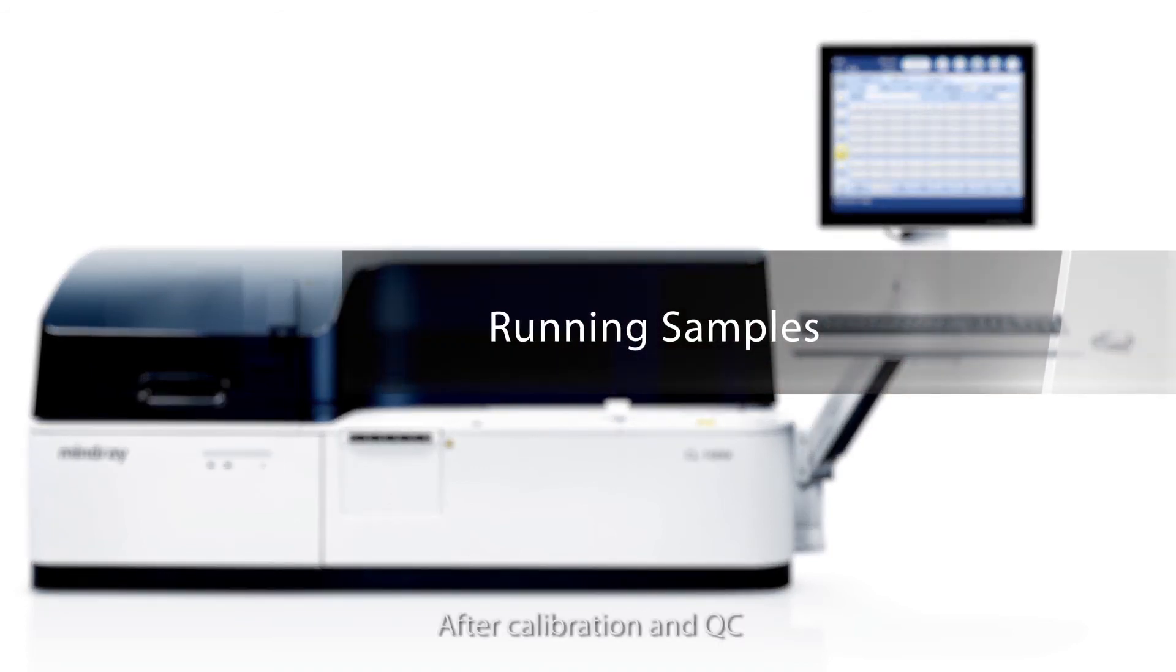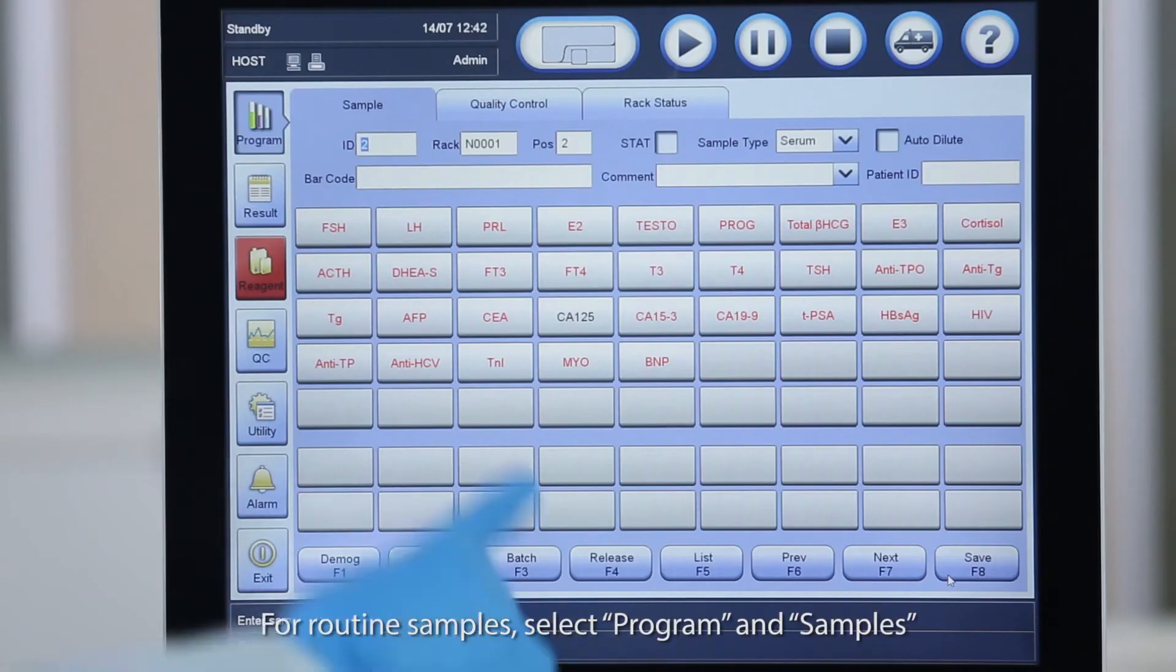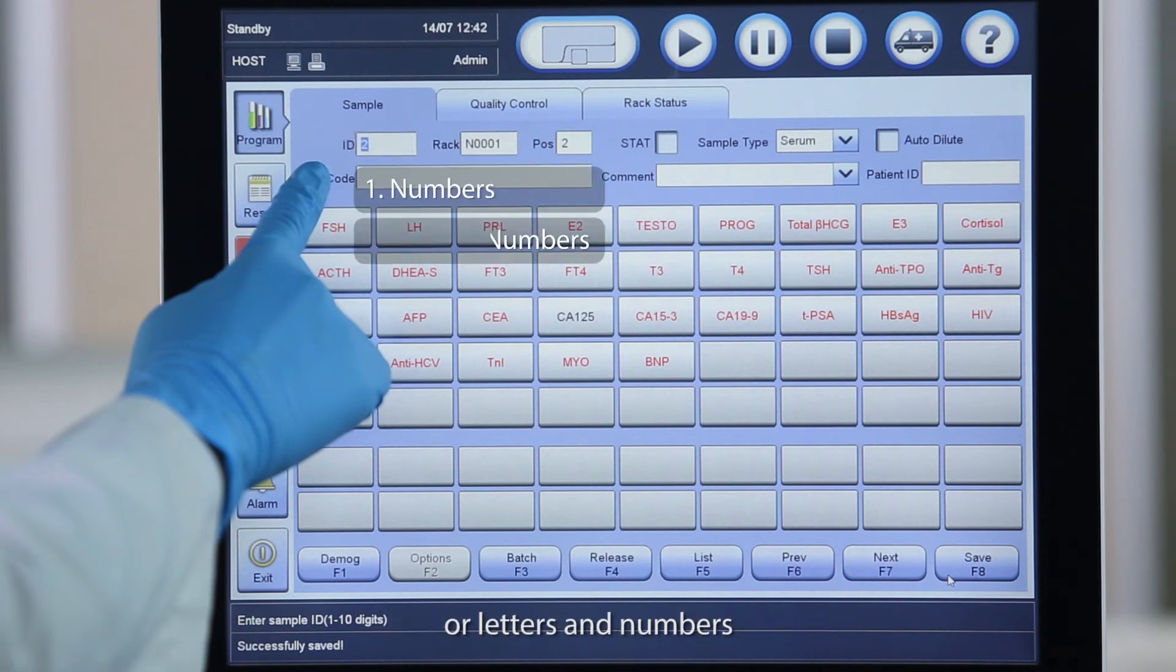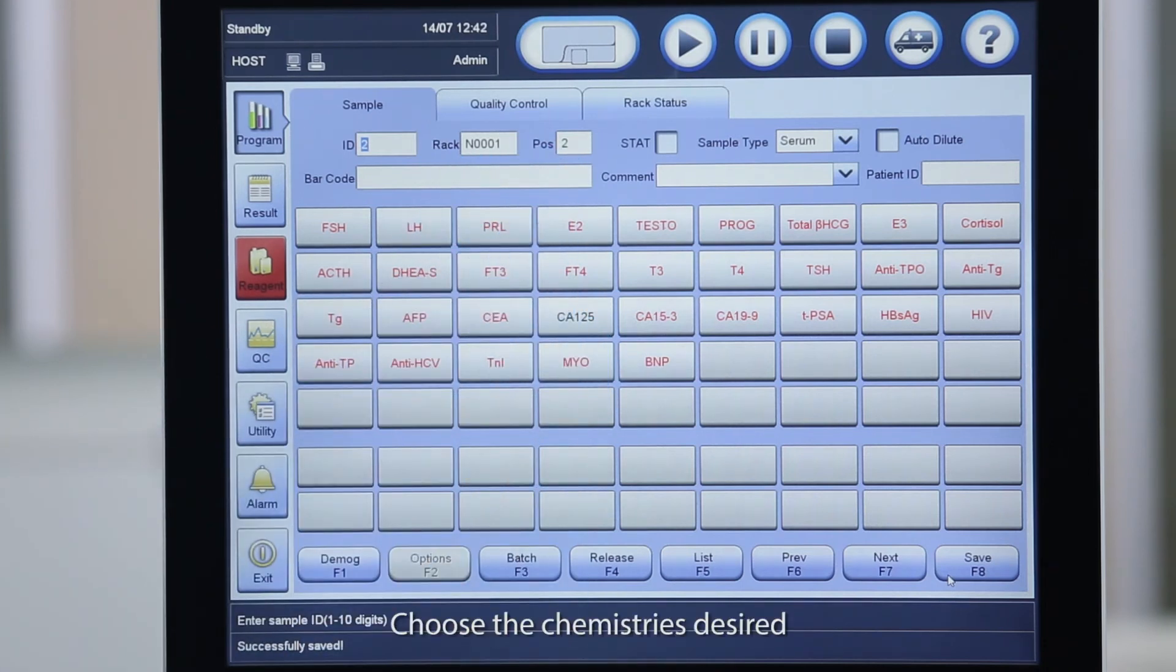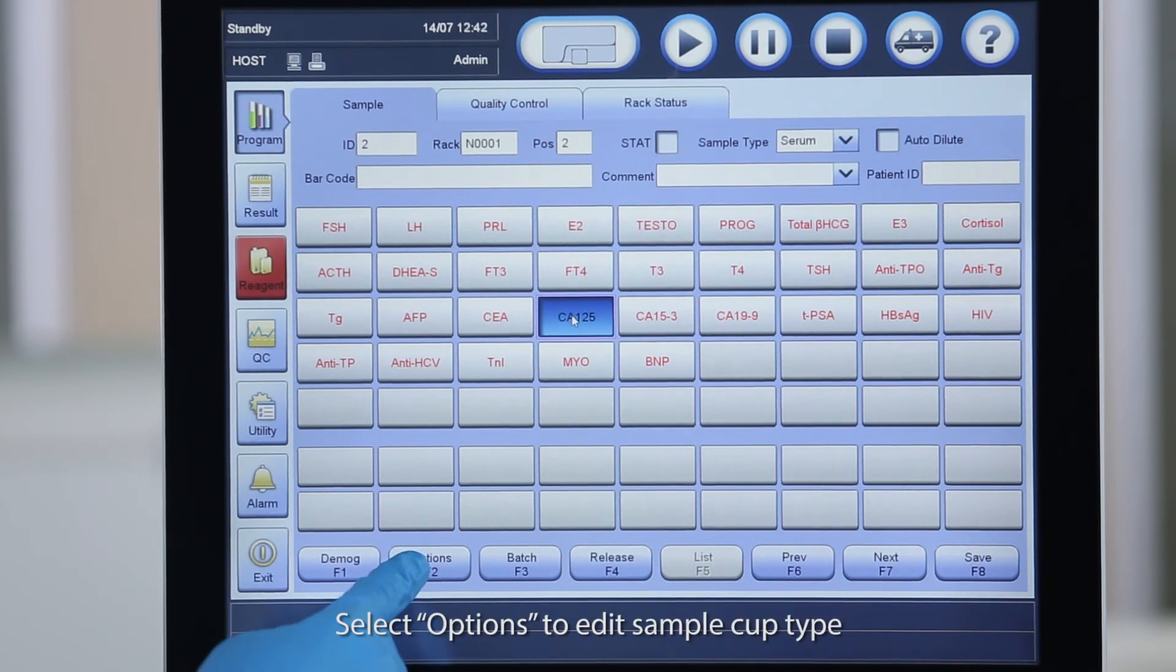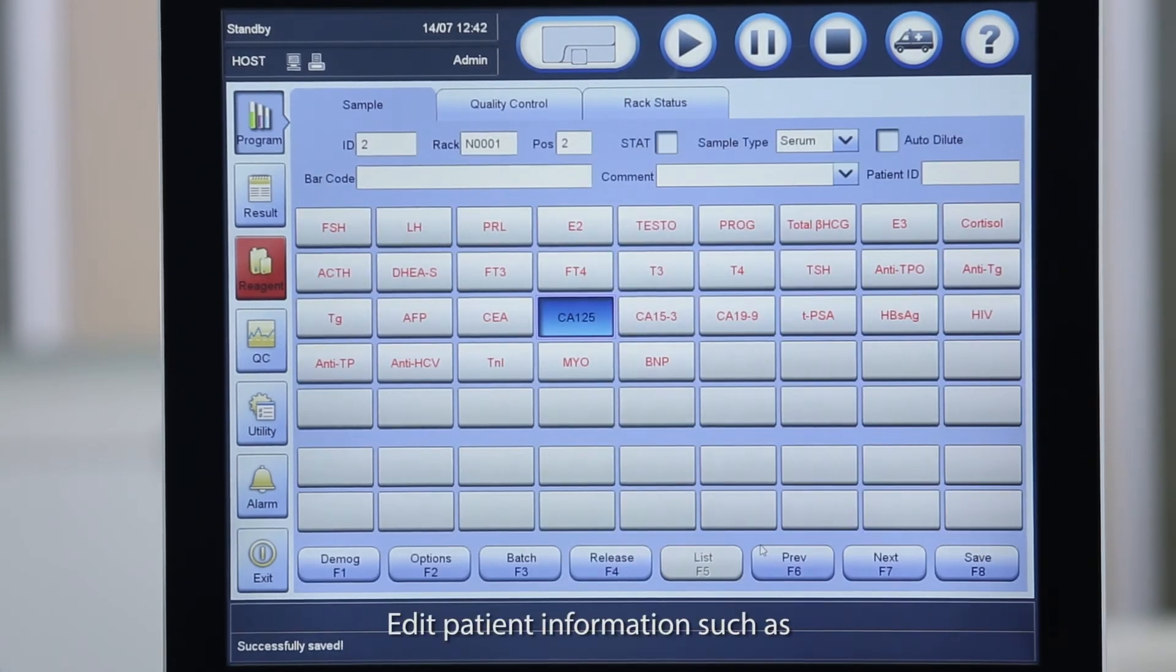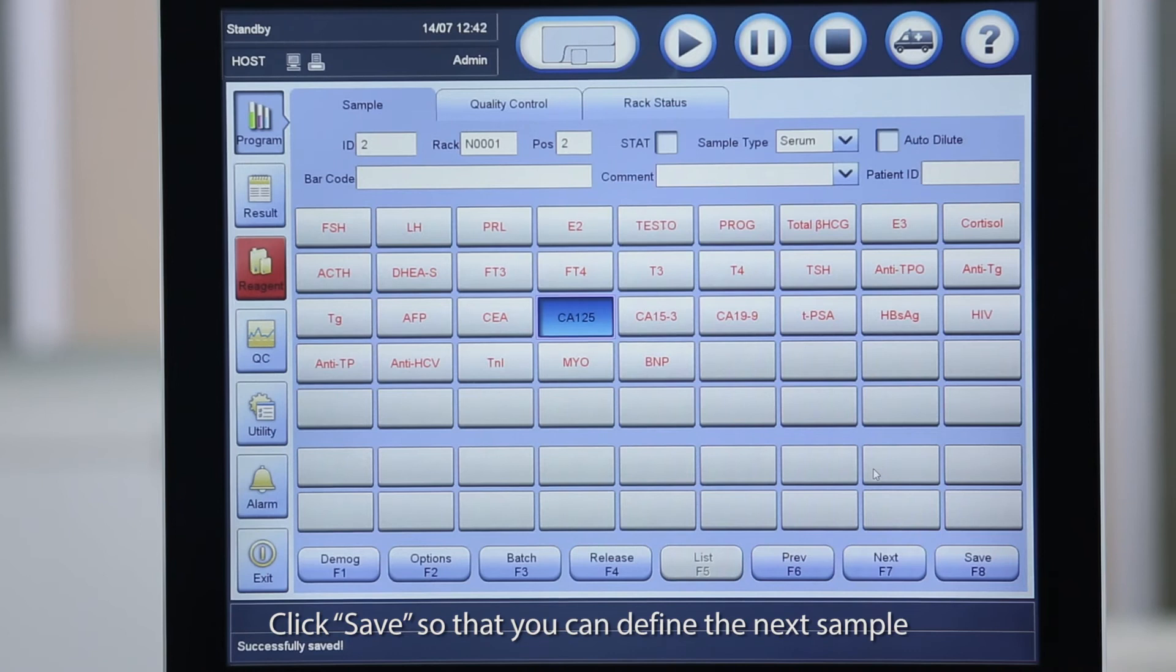After calibration and QC, we can run samples. You can run both routine samples and stat samples. For routine samples, select Program and Samples. Enter the sample ID. Sample ID is composed of numbers or letters and numbers. Up to 10 digits can be entered. Input the Rack ID and position number based on the analysis mode. Choose the chemistries desired. Only those in black can be requested for analysis. Select Options to edit sample cup type, replication and dilution. Edit patient information such as age and gender in Demographics window. Click Save so that you can define the next sample.